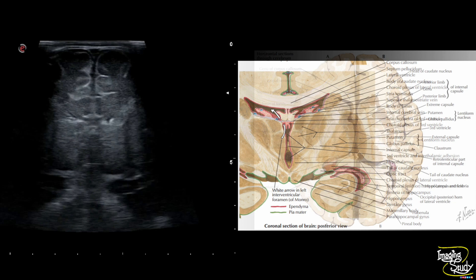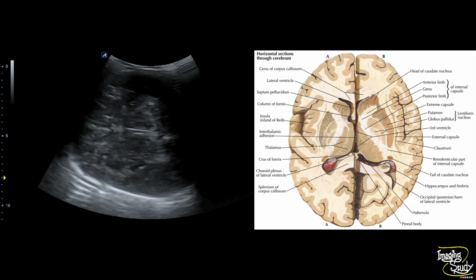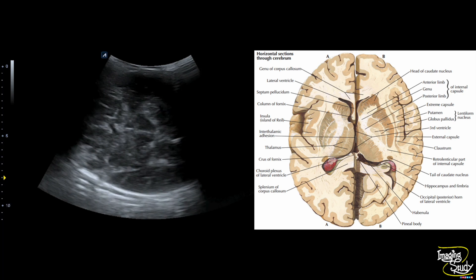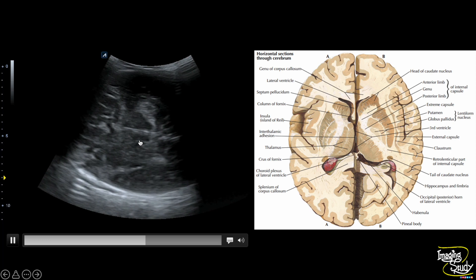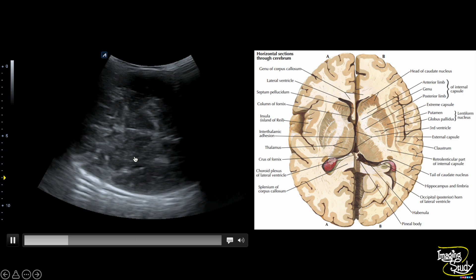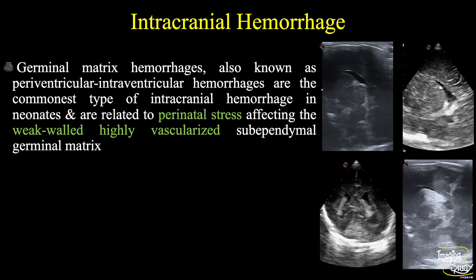Here is the axial section — quite the same image as you see on the right one. If you are an obstetrician or do obstetric ultrasound, this view is the same view you have seen in your biparietal diameter measurement. This is the falx and these are the thalamic regions. In today's session, I won't show you many images of axial section except one.